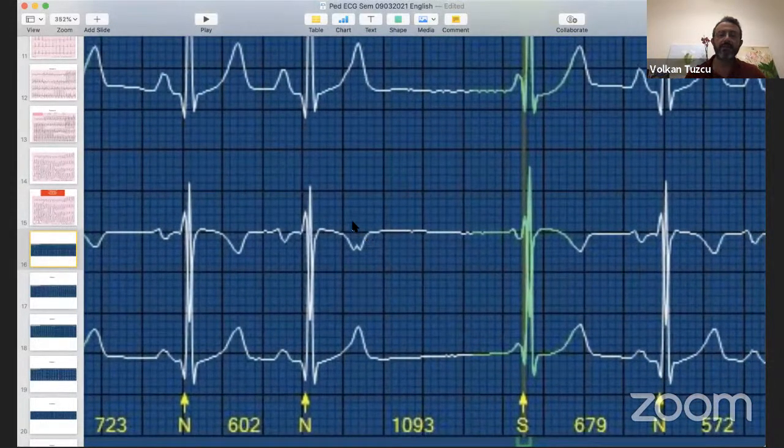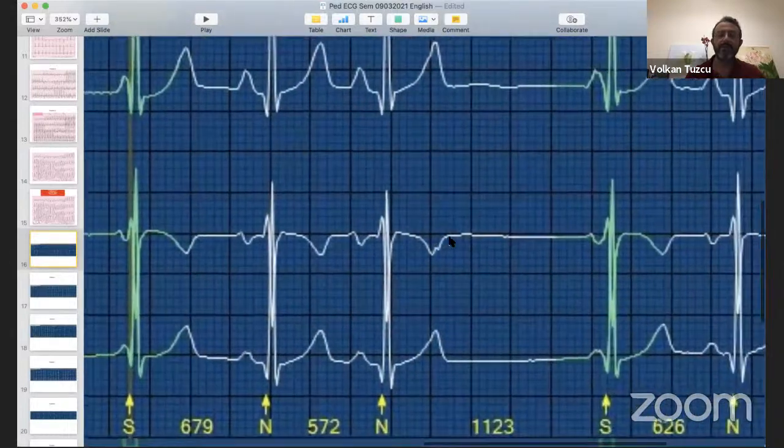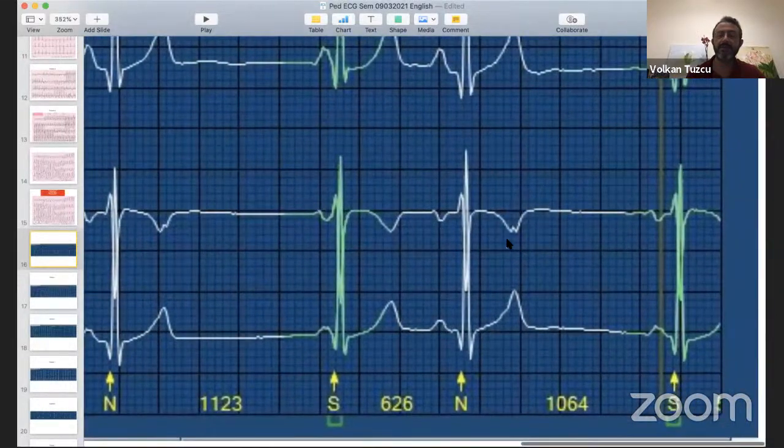And suddenly, look at this. And very nice, actually, this time, possibly a P wave. Okay, do I see it again? Yes, look at this. I see it again. With the other ones, I don't see it. When it's junctional or sinus, I don't see this thing. I see it just before the pause. Again, I see it. So there is for sure a PAC.